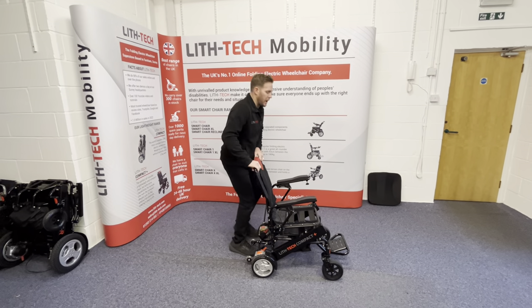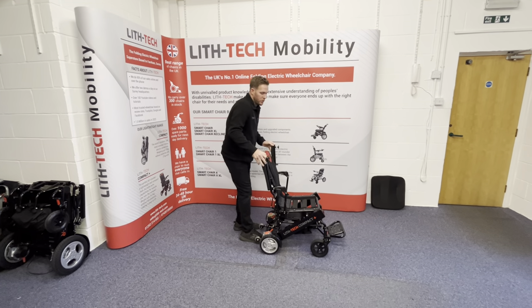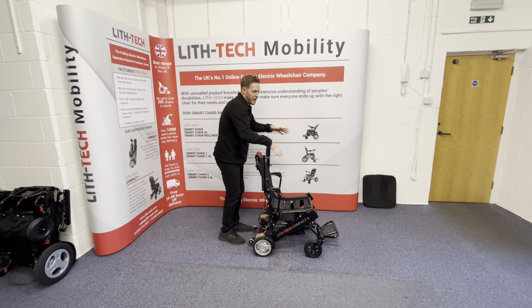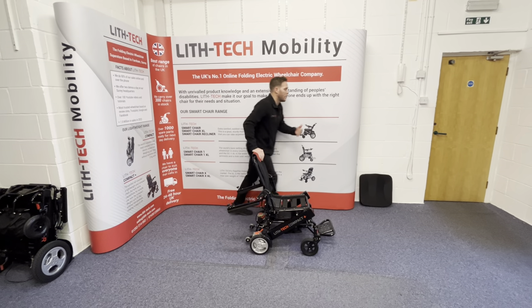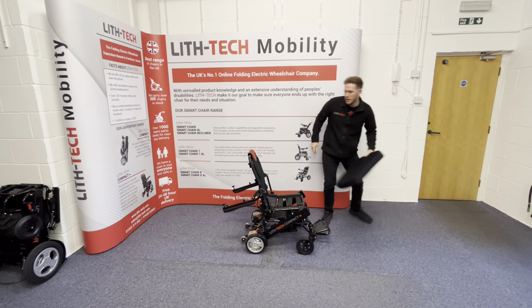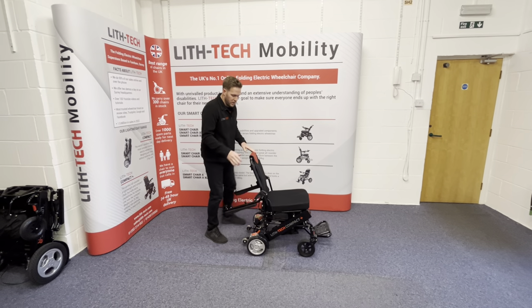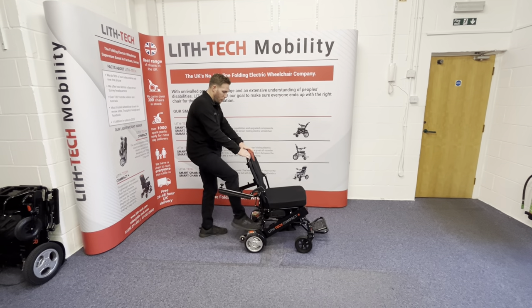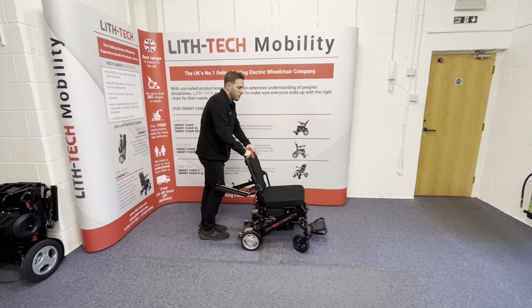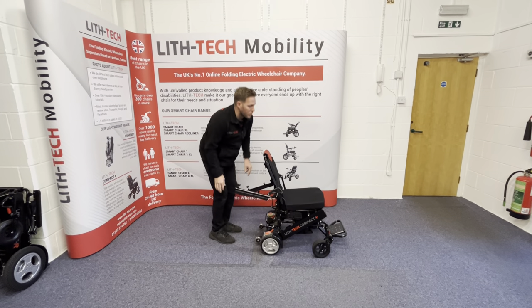The beauty of this chair is the armrests also fold completely back. Not only does it mean you can come in from different angles when getting in and out of the chair, but if you're someone who needs to stay in their chair the whole time, you can either have someone toggle you electrically under a table using the joystick, or you can pop the motors into freewheel mode and someone can push you underneath a table for eating, drinking and working.